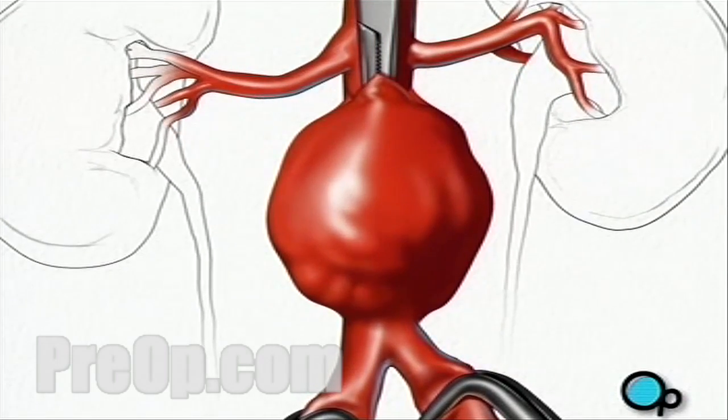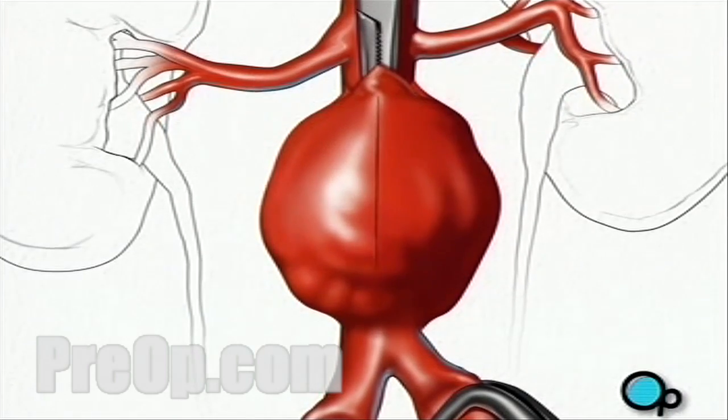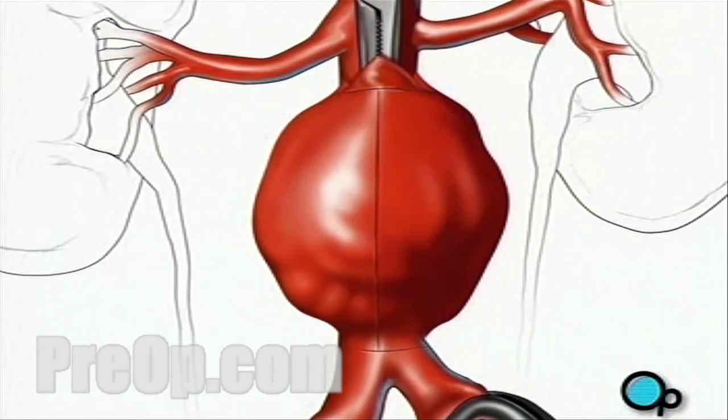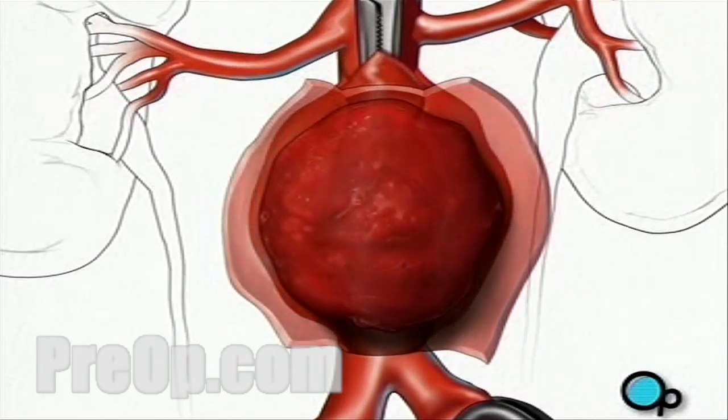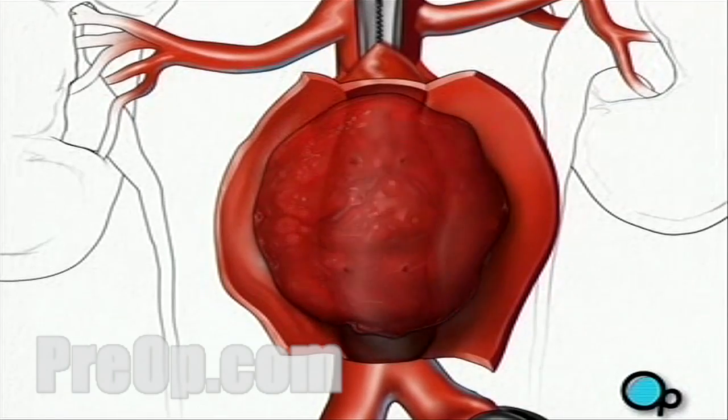Once the blood supply has been shut off in this manner, your doctor will make a vertical incision in the artery wall and two small horizontal incisions to allow access to the damaged area. The blood clot can then be removed.